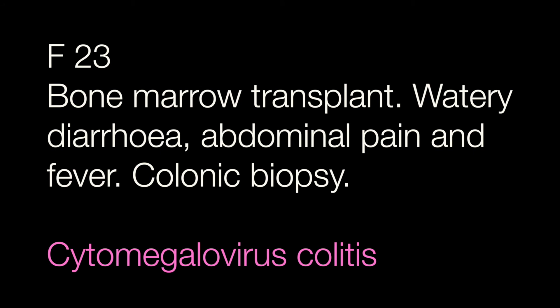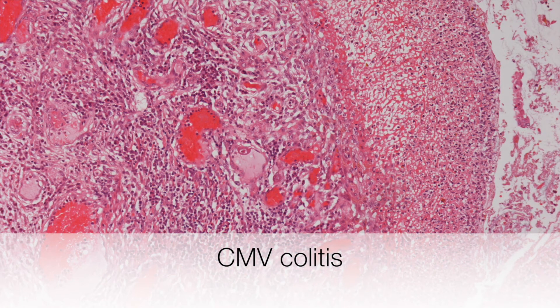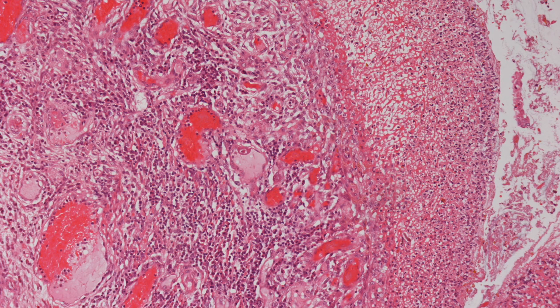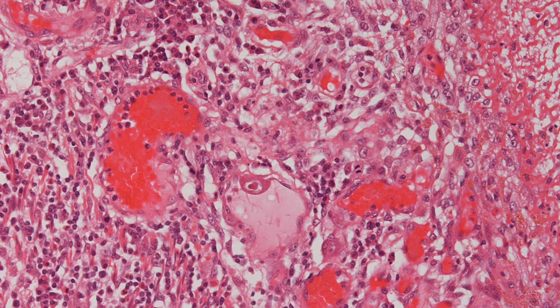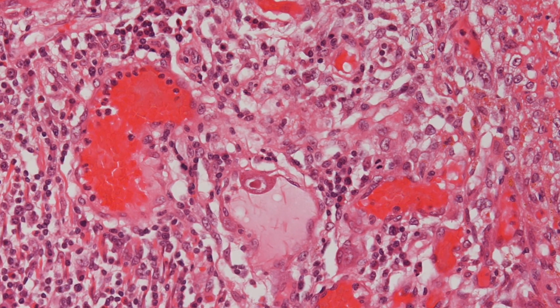The final case was the female of 23 who had a bone marrow transplant, suggesting that she was immunocompromised, and the diagnosis is CMV colitis. The histology of the colon shows ulceration, and as we zoom into the endothelial cells you can see a classical owl's eye CMV inclusion.